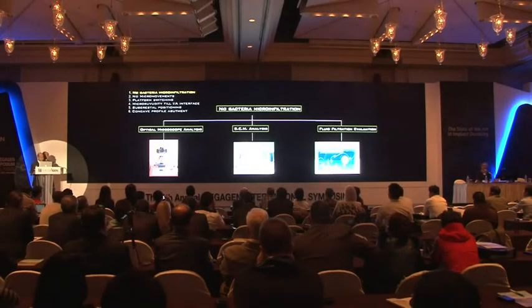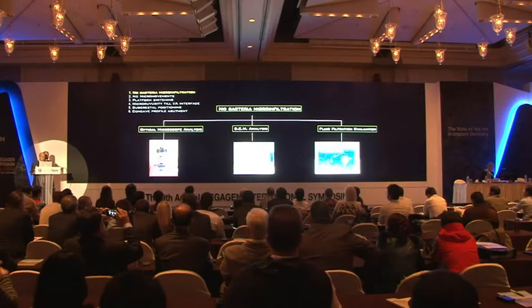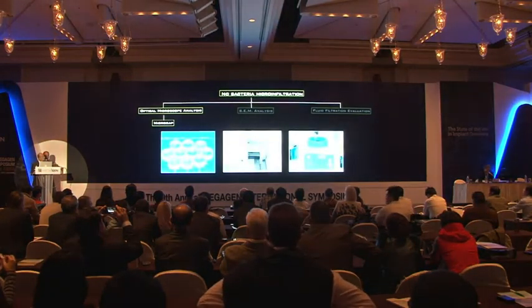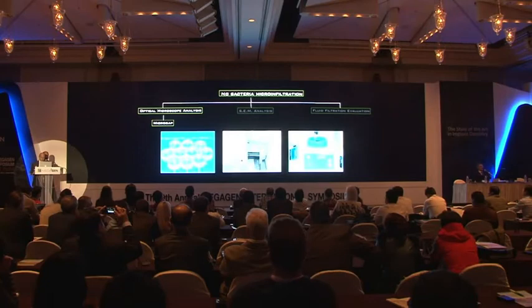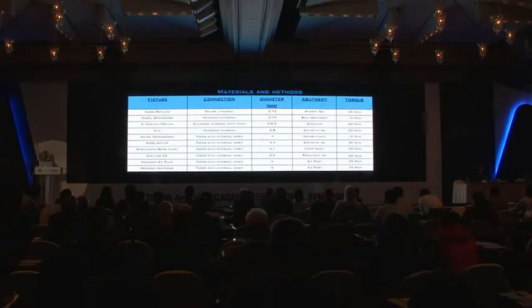In our department, we scientifically analyzed the microinfiltration in different implant systems, and now we show the first step, which is the optical microscope analysis. We took 4 flat-to-flat connection systems, as you see in this scheme, and 6 tube-in-tube connection systems, closed with the recommended torque, and we analyzed them.